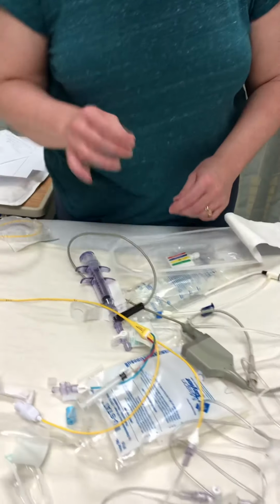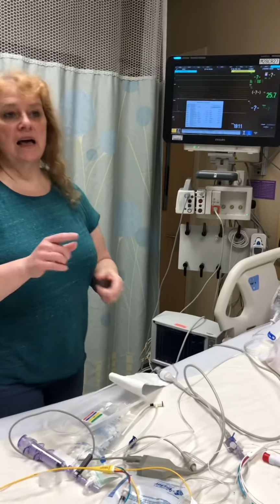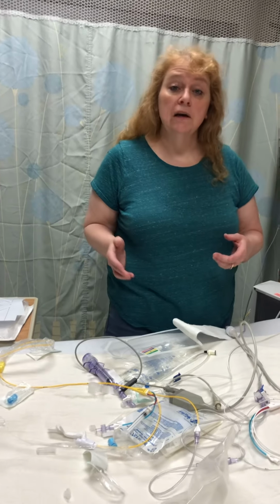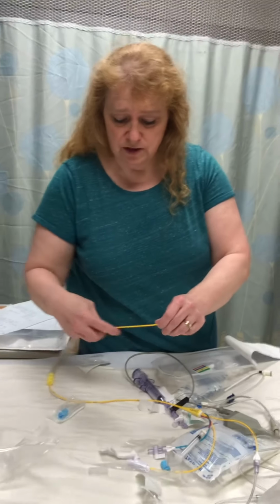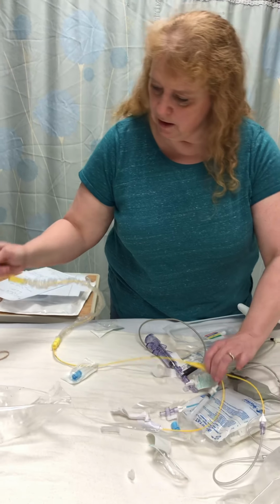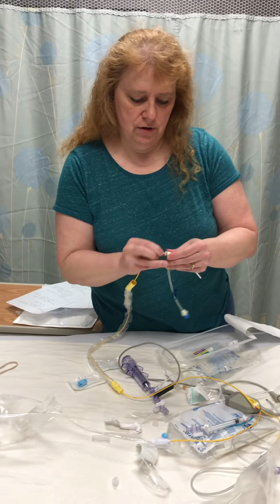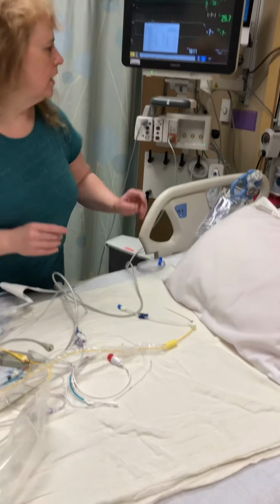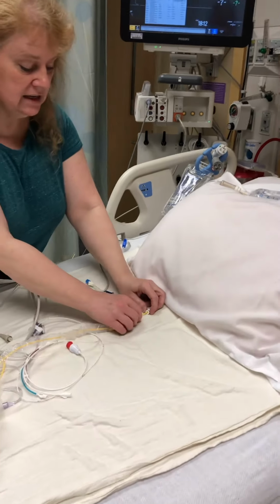And then when you pull the swan, you're going to want to also look up at your monitor, because as it's going through the right ventricle, it may actually cause a little bit of ectopy. So you just want to make sure and watch for that. When the swan comes out, it's going to be in the introducer, attached to your patient like this. And when you pull this, you're going to tell the patient, take a nice deep breath.